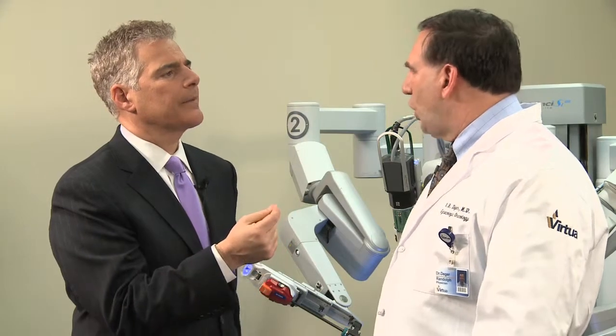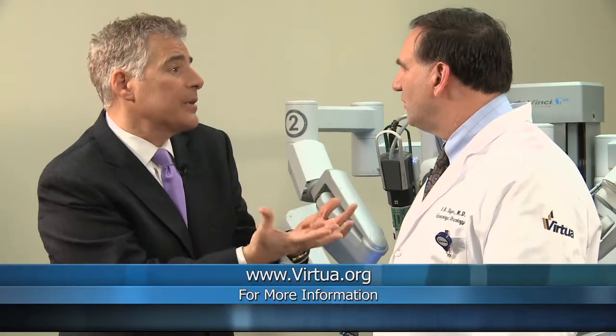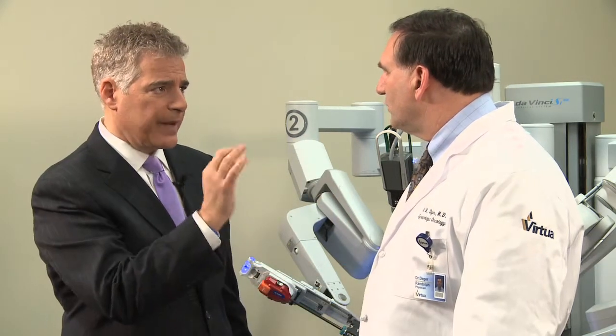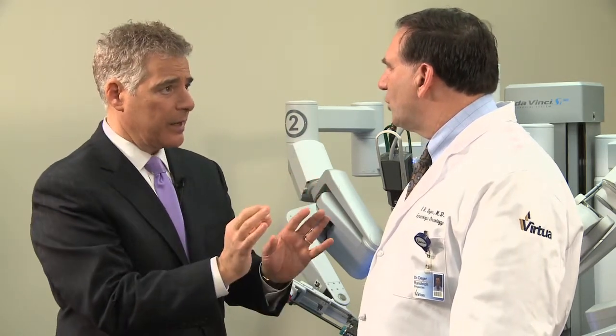Haptic response. Well, in open surgery, you're able to feel how the needle, for example, goes through the tissue. In this particular circumstance, we rely on our experience as well as the excellent visualization to protect us. From the patient's perspective, which is what we're concerned about, how is the patient protected there? By the surgeon's experience, clearly. So the patient knows, based on that experience, how hard to press and how hard not to press. A robotic surgeon has that training to prevent any kind of problems from happening. So the key is the training. That's correct. The key is the experience.